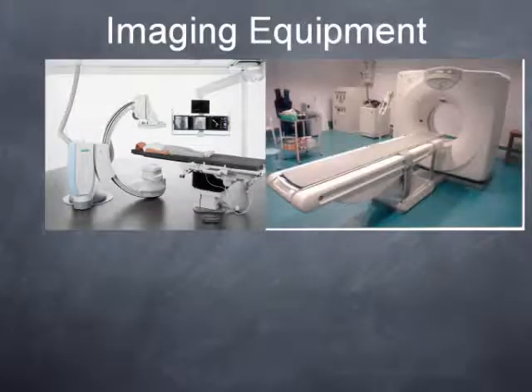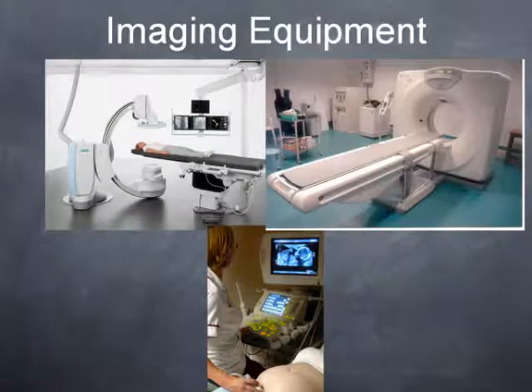We also use CAT scan to guide procedures. We can do ablative therapies, biopsies, all kinds of different types of procedures using the CAT scan guidance. And finally, we use ultrasound guidance daily to guide different procedures, and we'll get more into that later.